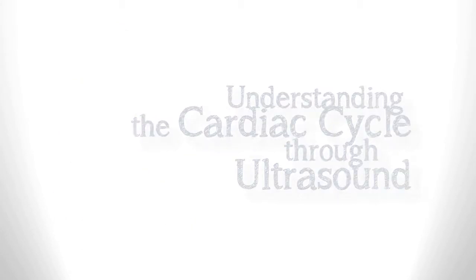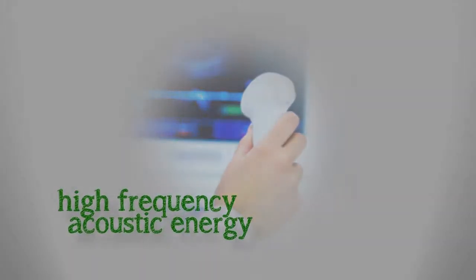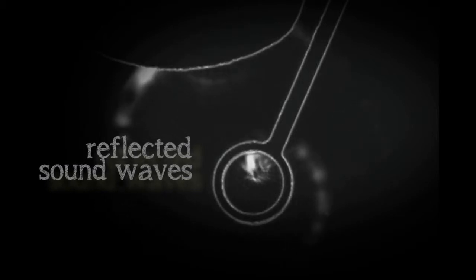An ultrasound machine works by transmitting high-frequency acoustic energy to the body through an ultrasound transducer. When the sound waves hit the boundary of soft tissue or bone, they rebound back to the transducer. These reflected sound waves are used by the machine to calculate the distance of the transducer from the tissue, and piece by piece produces an image.